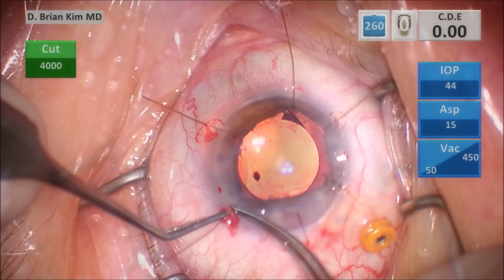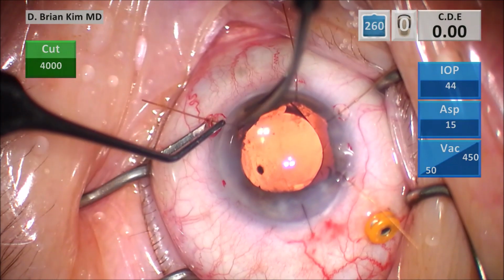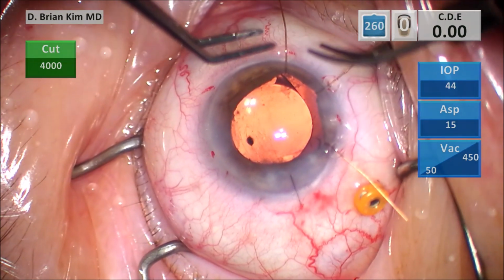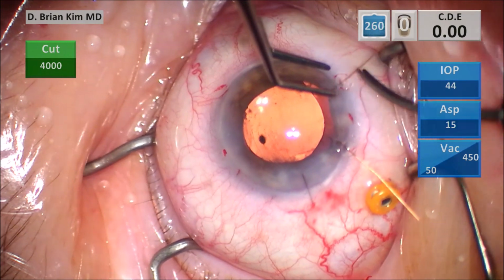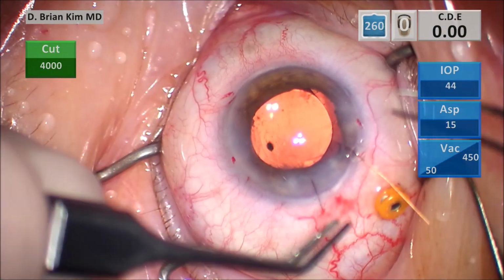This lens is well centered now. Go ahead and hydrate all of the incisions. And again, the single piece acrylic lens within the bag, whenever you can preserve the bag, is really the best position for the lens, not scleral fixating, not eating the bag and abandoning it. You really want to keep the bag whenever you can, especially since there's really good zonules.